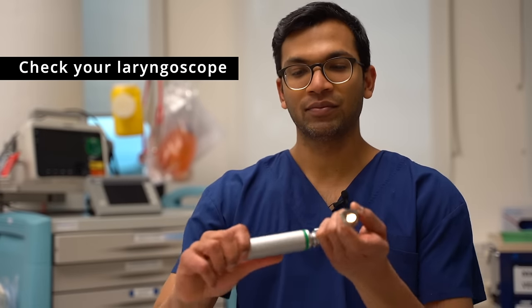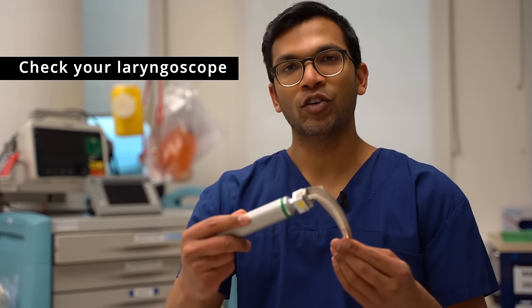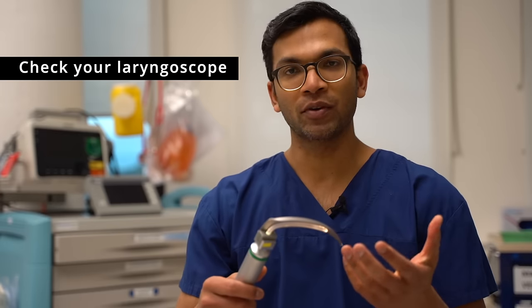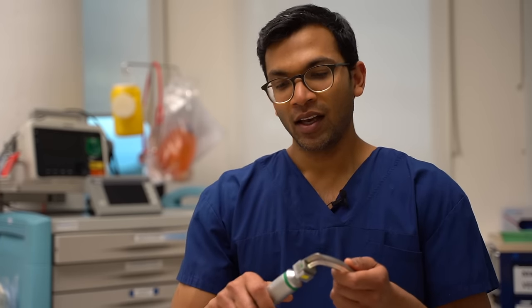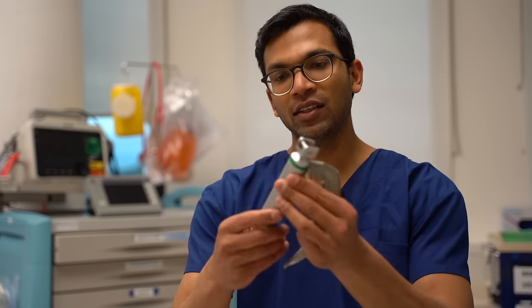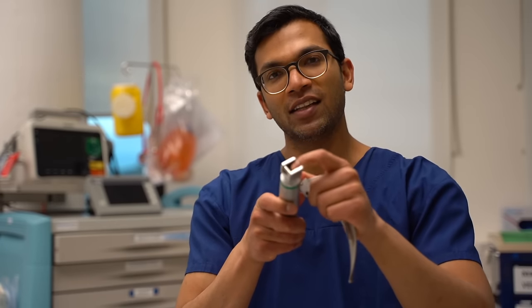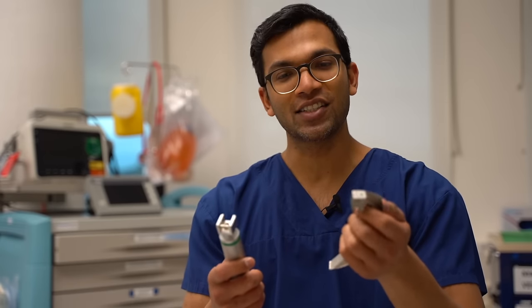This is a laryngoscopy blade — a size 4 Macintosh blade, probably one of the most common ones you'll see. It consists of this handle, which is a power source. You can check the light by just depressing it there. The blade comes in quite a number of sizes, but the common sizes in adults are size 4 and size 3.